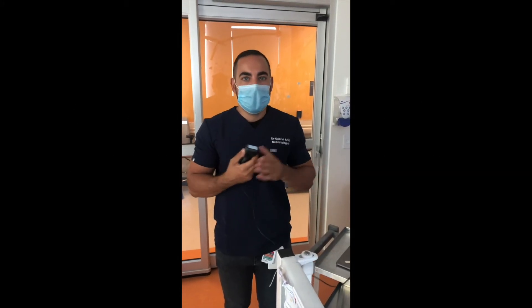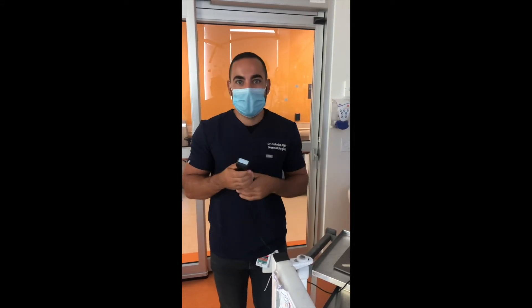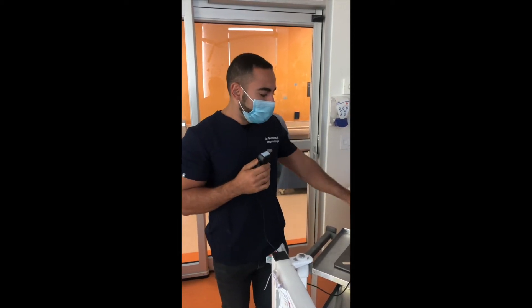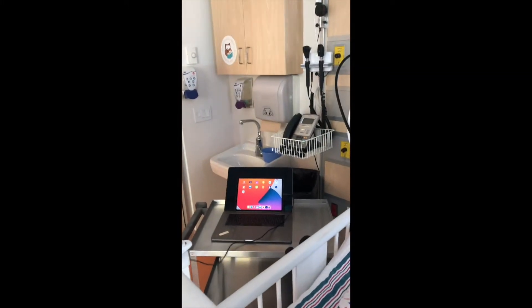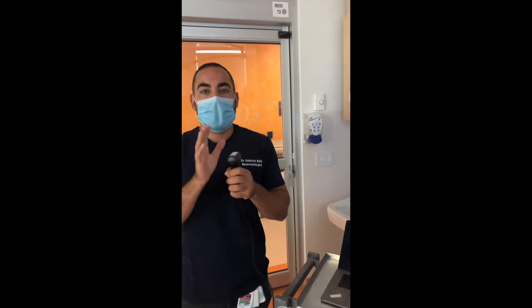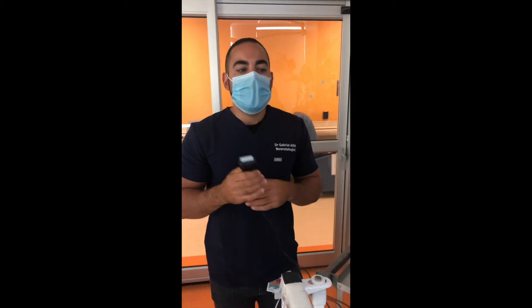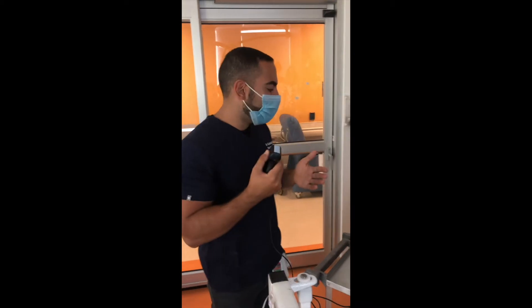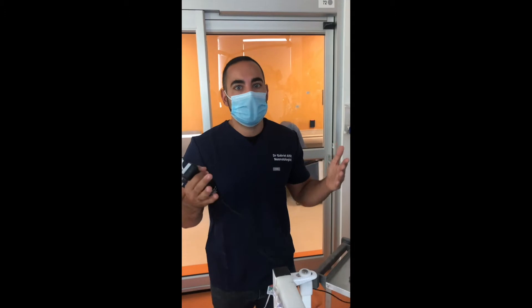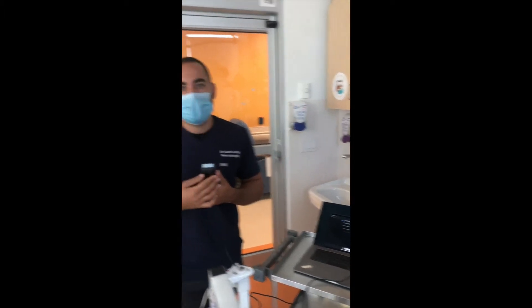We are at the bedside of one of our patients here in the NICU with parents who have graciously accepted to be part of the experience. I have my setup with my iPad secured, my probe, and I have already cleaned my hands and the probe. Now I will be putting some ultrasound conducting gel in order to acquire some images. In order to acquire as good images as possible, I try to obtain lighting in the room that is as dark as possible so that I can appreciate well the resolution and contrast on the screen.